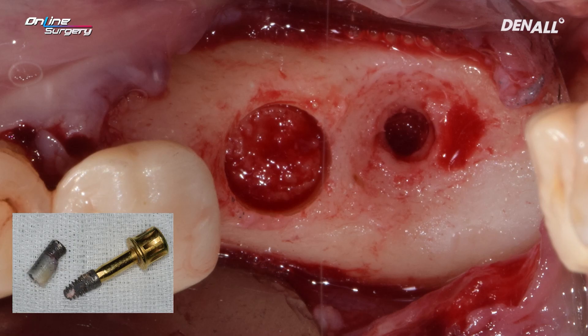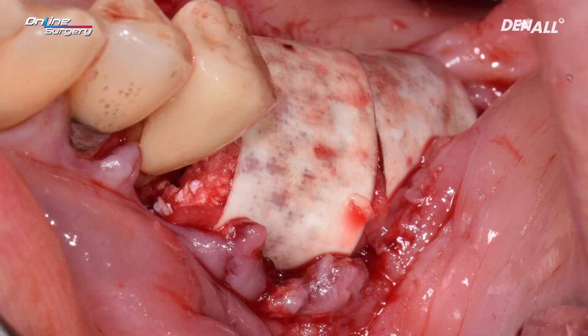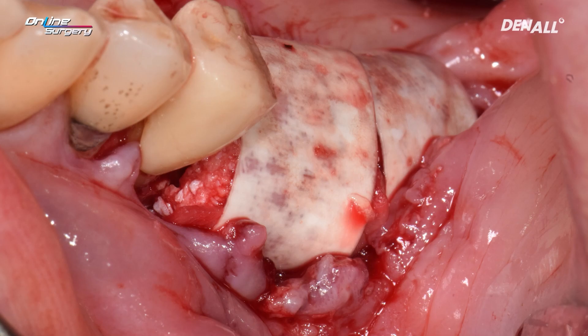First, the implants were explanted. The vertical bone defect was severe, so GBR was performed to recover it. A non-resorbable membrane would normally be the right approach for recovering vertical bone deficiency. However, in this case the soft tissue contour was not good, and if a non-resorbable membrane is exposed, the result can be worse than not using the membrane at all. Therefore, a non-resorbable membrane was not used.